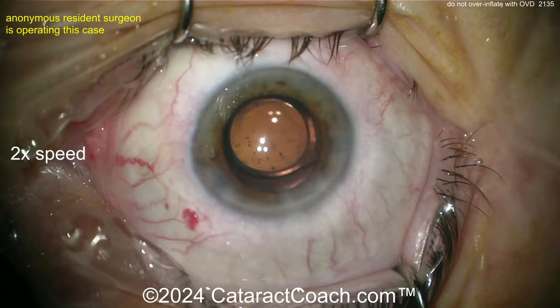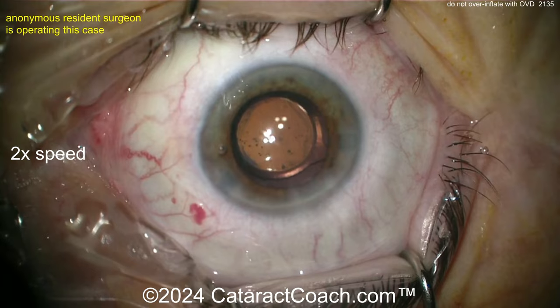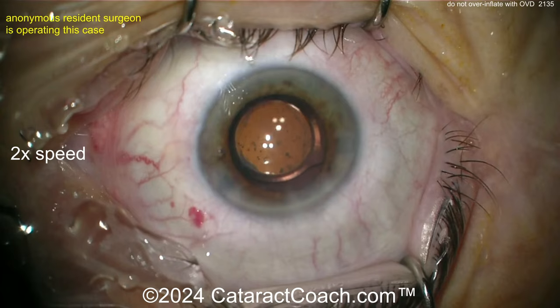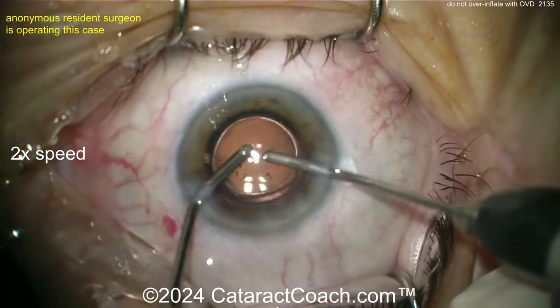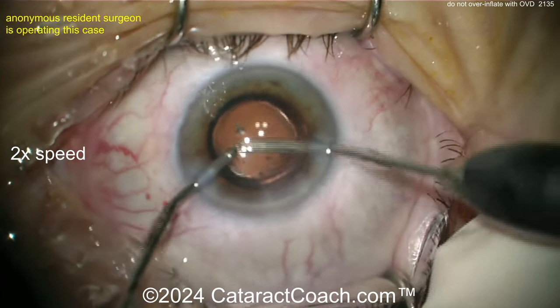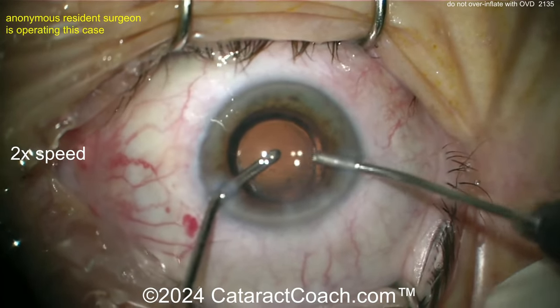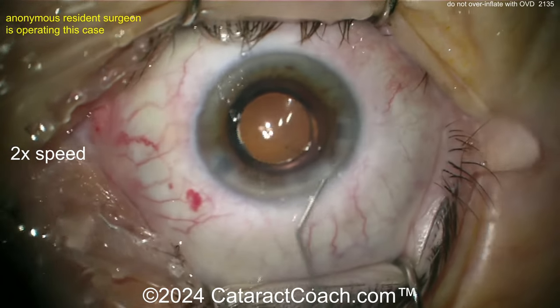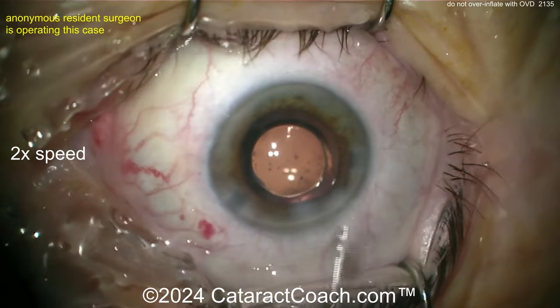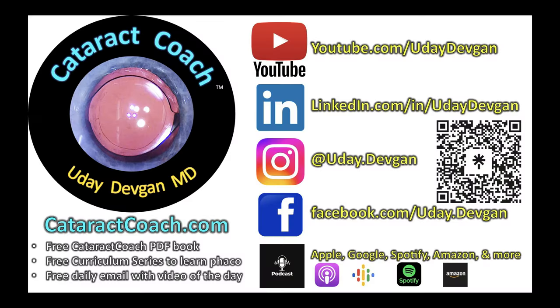Good job. As a young resident, you're doing a great job. You need to be careful of the viscoelastic, because too much viscoelastic can put pressure on that capsule and cause it to radialize. And mostly, you've got to fix the draping — we can't live with this draping; it also has more risk for you. Now IA coming in by manual approach, being just very slow and gentle to not cause too much disruption as the viscoelastic comes from behind the IOL forwards. Be very cognizant of that one radialized area, because the last thing you need is for that to rip around and have more issues. Seal up the incisions, call it a day. If you're a resident, I have a huge amount of free resources on CataractCoach.com — there's a 25-part curriculum series, REX's danger zones, and an amazing podcast every single week where we spill all the secrets of ophthalmology.